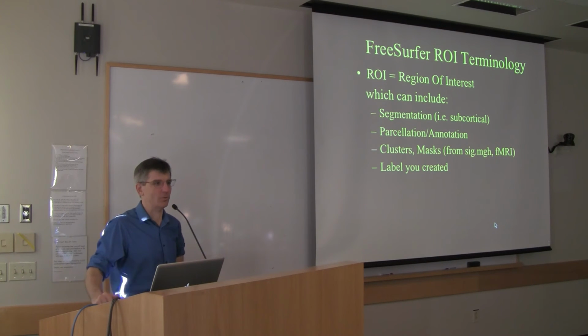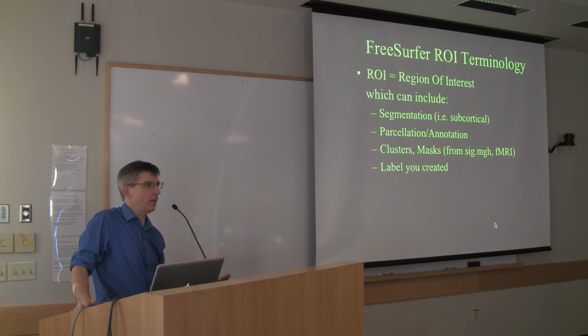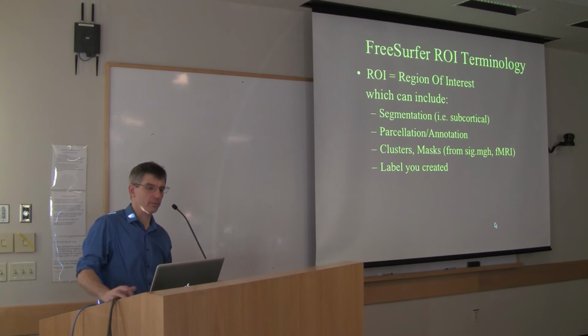And I'm really just scratching the surface. I can think of at least 2 more ROI atlases that we have, one based upon functional connectivity. So I'll change gears here slightly and start talking about these ROIs more specifically in terms of FreeSurfer, and how do you actually navigate through FreeSurfer to understand these ROIs.